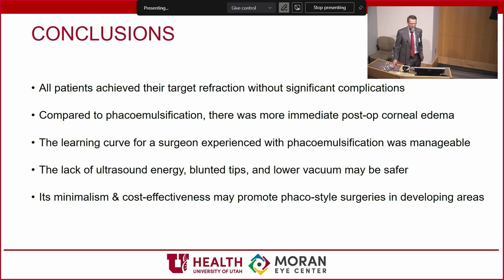Yeah, it's been interesting. So my communication with Zeiss, again, I am a consultant, and I've really pushed them on this, and I said, yeah, there's still more edema. And they said, oh, we thought the problem was solved with using a dispersive, and well, that doesn't really solve the problem if it's still causing edema, and if you have to use a dispersive just to keep corneas clear. So again, there's a number of things. Well, there's not a lot out there published at all, number one. The things that you can find, Randy, are that this is the greatest thing since sliced bread.